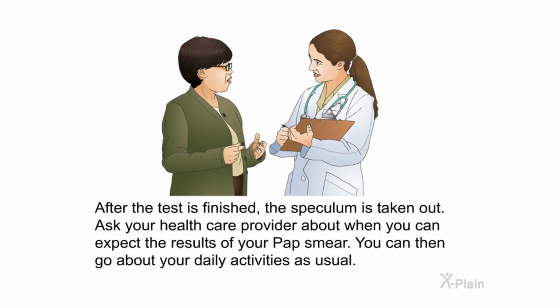After the test is finished, the speculum is taken out. Ask your healthcare provider about when you can expect the results of your Pap smear. You can then go about your daily activities as usual.